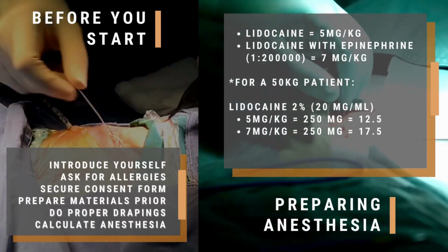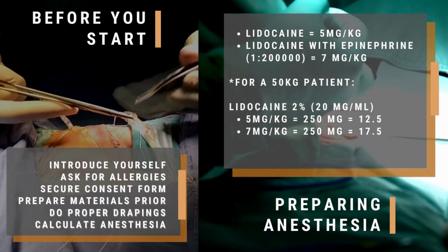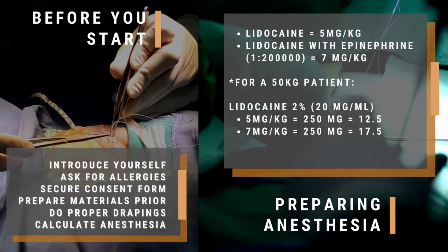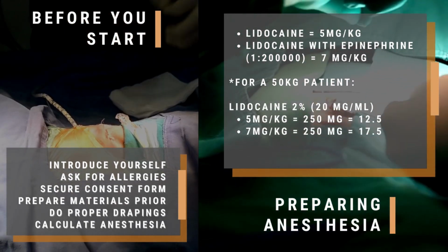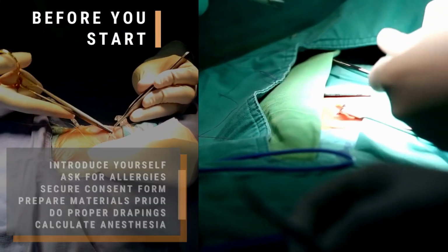Before you start, make sure to introduce yourself, ask for allergies, secure consent form, prepare materials prior, do proper drapings, and calculate anesthesia. For lidocaine, it's given 5 mg per kilogram. Lidocaine with epinephrine, 7 mg per kilogram. Here is a sample computation for a 50 kg patient.